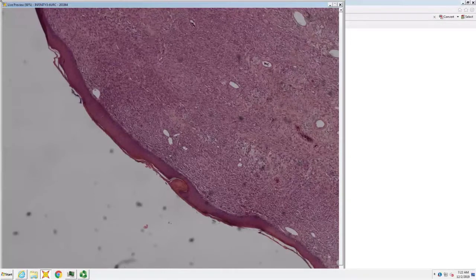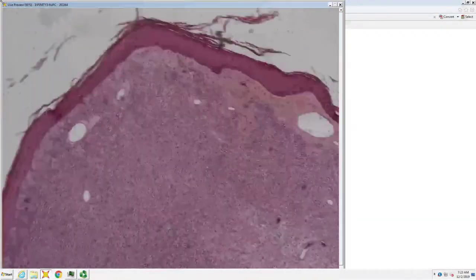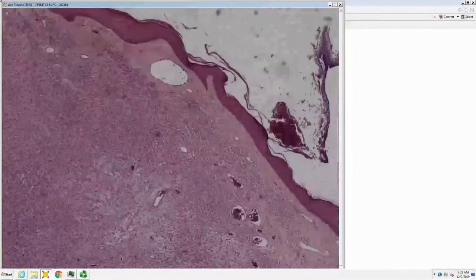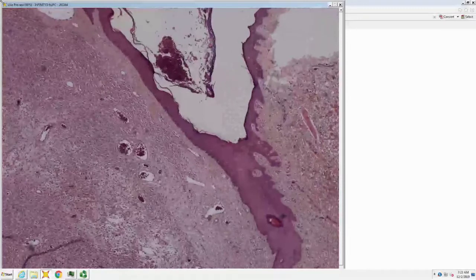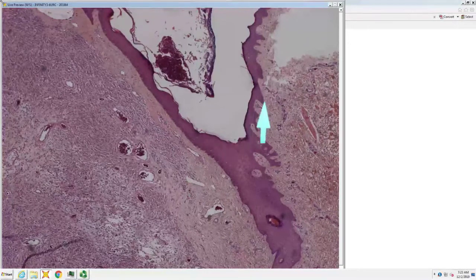Go ahead. In effaced epidermis, I see spindle cells. So effaced. The rete ridge pattern is gone. So is it then skinny and effaced, or is it a plate-like acanthosis where it's actually as thick as the bottom of the rete pegs would be?